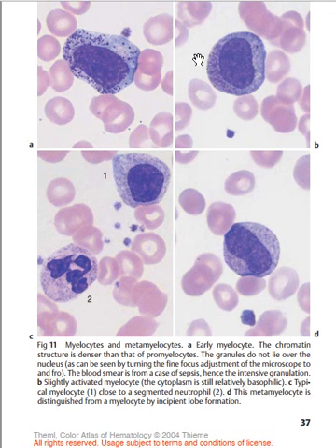Now, this is an activated myelocyte here in the cytoplasm. So, activated myelocyte here in diagram B. The next one is diagram C. We have typical myelocytes also. You see heterochromatin that you can visualize in this myelocyte, condensed heterochromatin. This is already a neutrophil that has completely been produced.